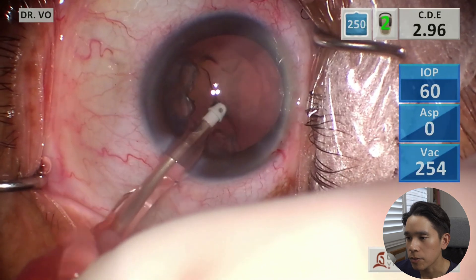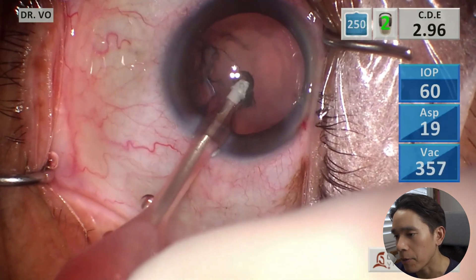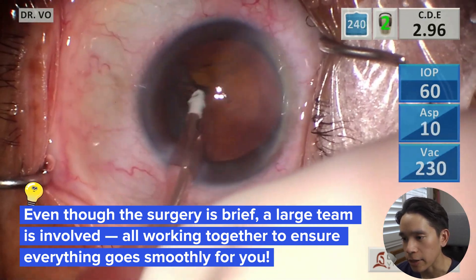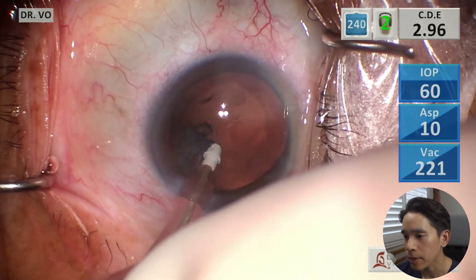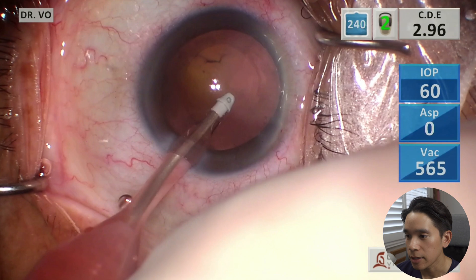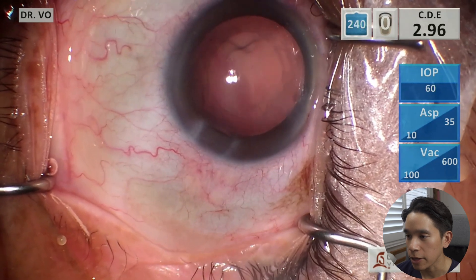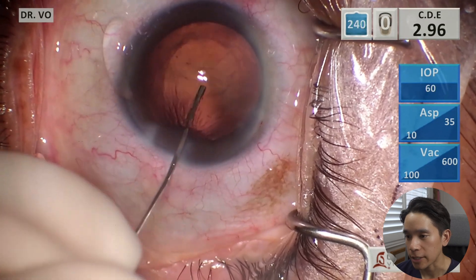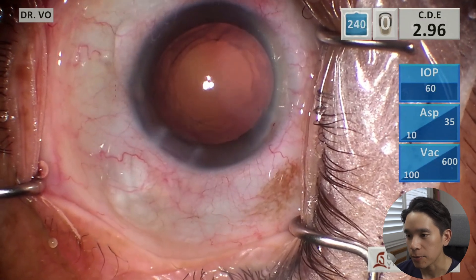During this step, the surgical tech is preparing the lens, so there are a lot of moving parts happening inside the operating room all at once. The anesthesiologist, your surgeon, their surgical tech, the scrub nurse — everyone's kind of playing a role in making sure that your surgery goes well and smooth. I'm just about done removing all the bits of the cortex of the cataract, checking to make sure there are no residual fragments and it looks nice and clear. Then I'm going to go ahead and inject some of that viscoelastic jelly-like material to help inflate the capsule to make sure there's enough space for the lens to go in.